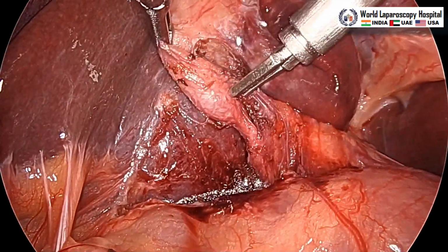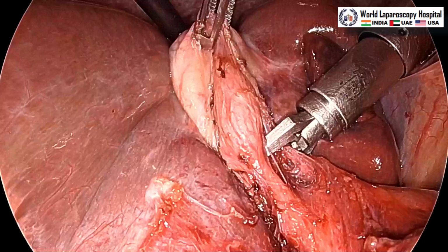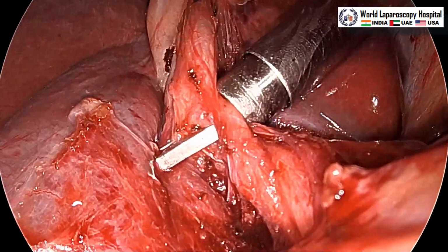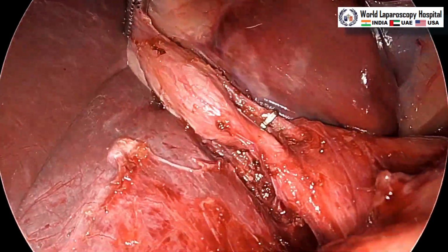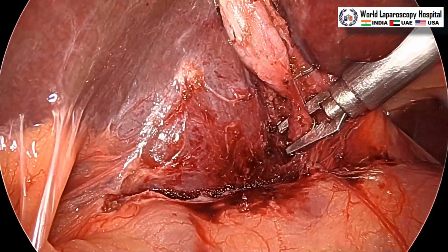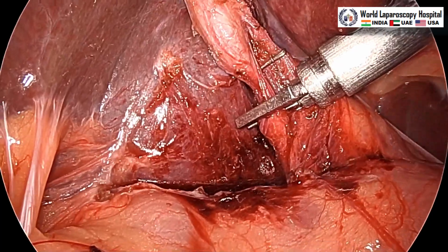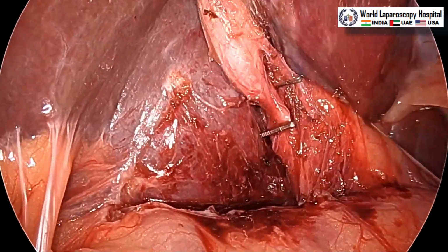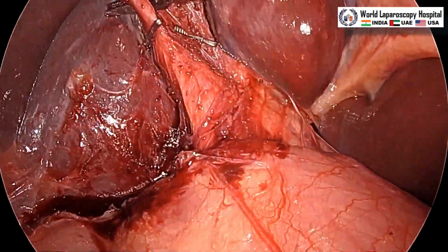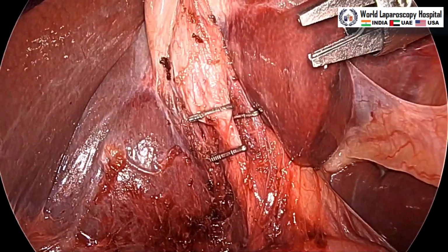Now, this is clipping the artery with the titanium clip. Both tips of the clip applicator must be clearly visible, and then you can clip the artery. After that the duct is clipped. Take care not to go very near to the CBD, we should leave at least 3 millimeter away from the CBD, so that lateral clipping of the CBD should not happen. So, this is the first clip. After that, we will apply the third clip, that is 9 millimeter away from the first one, and then the second clip 3 millimeter away from the first one.